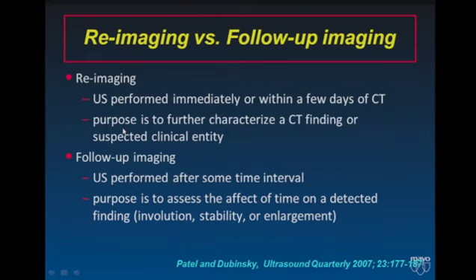There is a difference between the terms re-imaging and follow-up imaging. Re-imaging refers to when an ultrasound is performed immediately or within a few days of the CT. The purpose of re-imaging is to further characterize a CT finding or a suspected clinical entity. Follow-up imaging, on the other hand, is when ultrasound is performed after some time interval, and the purpose here is not only to evaluate the CT finding, but to establish the effect of time on that finding, either showing that with time the mass or cyst has involuted, is stable, or has enlarged.